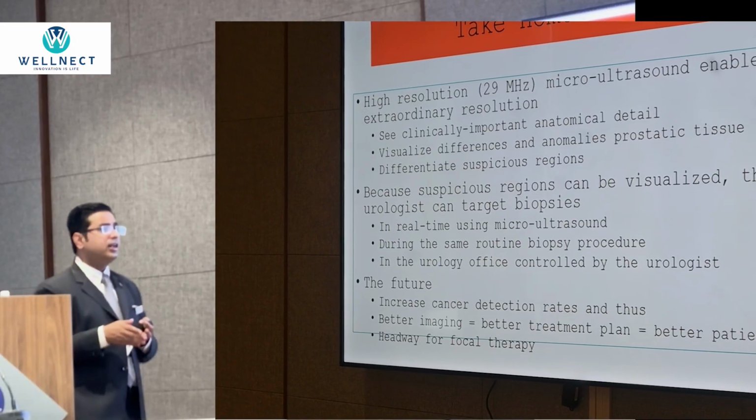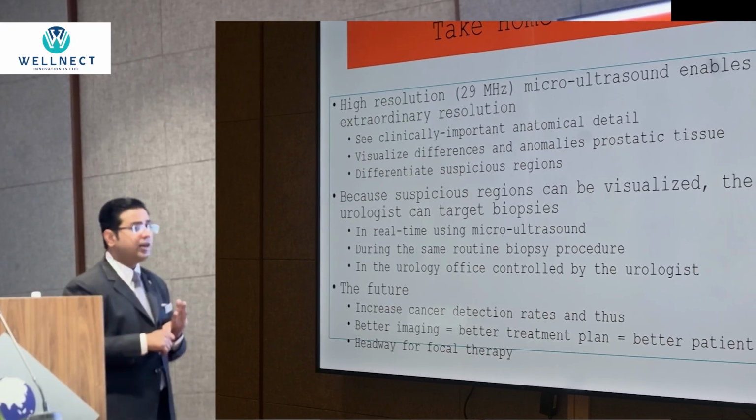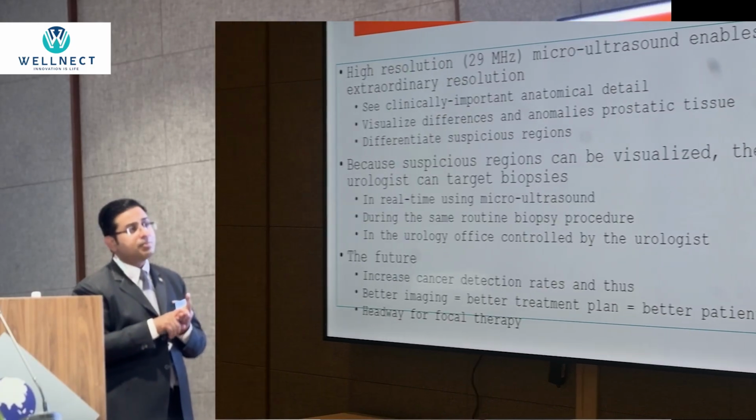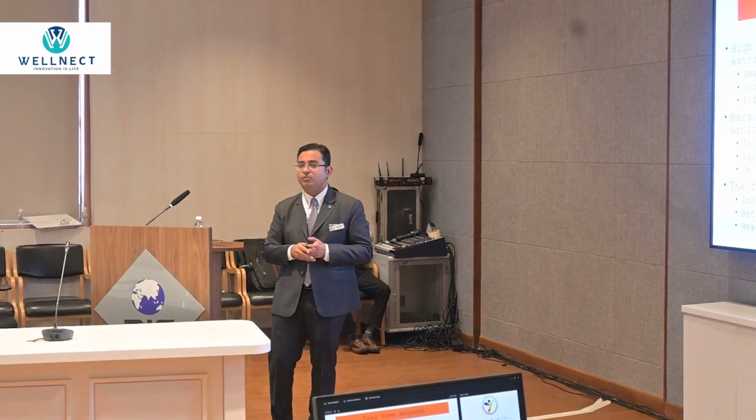And the future is that we may pick up clinically significant cancers better. If we are able to monitor disease, we'll be able to do active surveillance better. And this will practically pave the way for focal therapy, because it'll get the controls in our hand, and we'll be able to predict lesions better, and eventually it'll pave the way for focal therapy.